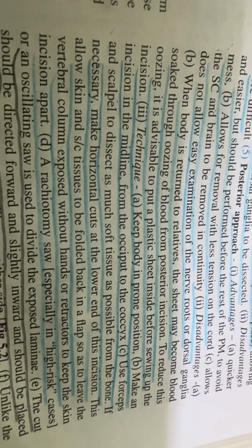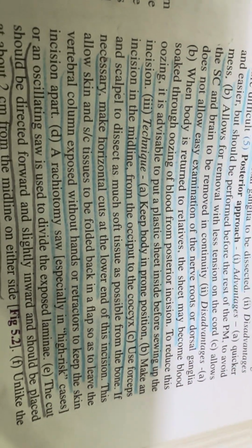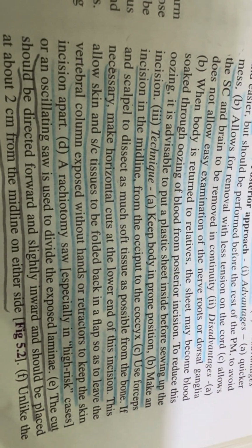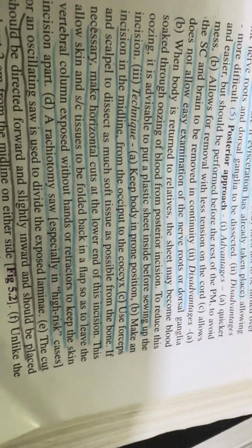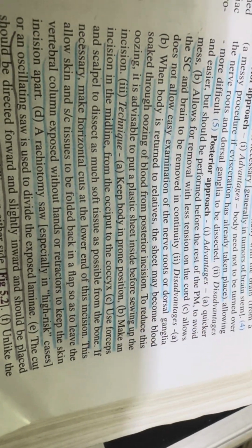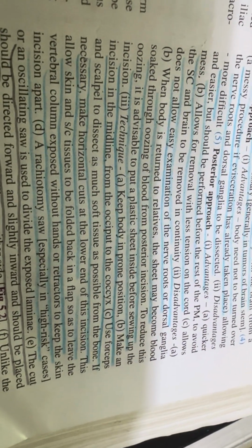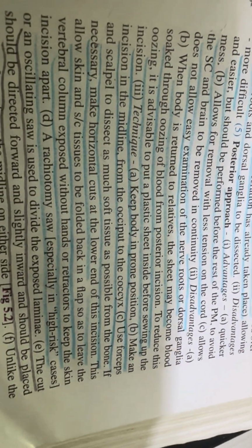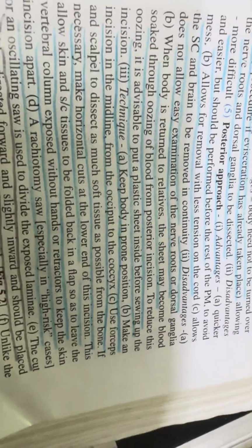When the body is returned to relatives, the sheet may become blood soaked through oozing of blood from the posterior incision. To reduce this oozing, it is advisable to put a plastic sheet inside before sewing up the incision. Technique: keep the body in prone position. Make an incision in the midline from the occiput to the coccyx.